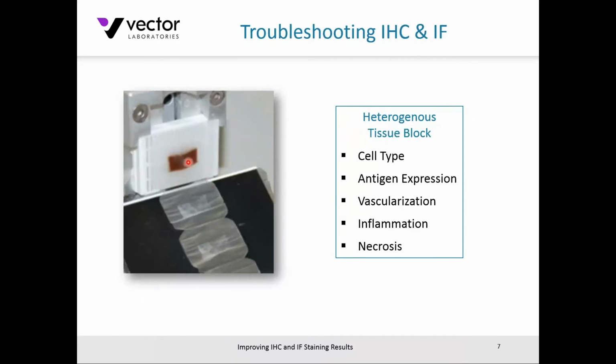And what I've got in this example is you're cutting into a block and you're cutting off these sections in a nice ribbon here, you might be getting further into a tissue block where there may be different cell types, for example, different cell components, different tissue components, maybe more Fc receptors, charged particles, macromolecules that could be contributing to background. There could be varying levels of antigen expression as you cut into a block, and indeed vascularization, whether it be angiogenesis, neovascularization, whatever you want to refer to that as, but really introducing more erythrocytes, for example, that may have more peroxidase activity associated with it. Just to give you an example of that, whether it be a xenograft model or tumor model, something like that.